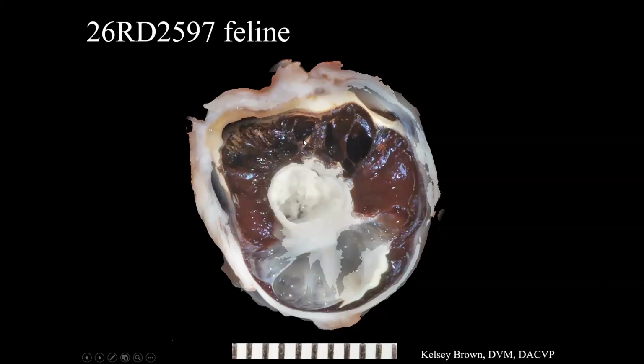A lot of this is just ciliary body that's become kind of distorted due to that anterior synechia. It also looks like maybe it's adhered to this lens material here. This is not a normal lens. It definitely has a hypermature cataract, so it's kind of misshapen and it is very opaque. And then looking at our vitreous, there's all these kind of little tan strands, kind of bridging from the back of the eye forward towards the back of the lens here. And there is technically an optic nerve head somewhere in here. It's just a little bit hard to see, possibly at this angle. And there is also kind of this tissue that's in the vitreous that might be obscuring it.